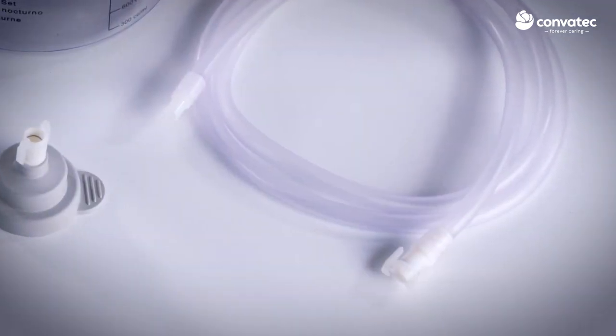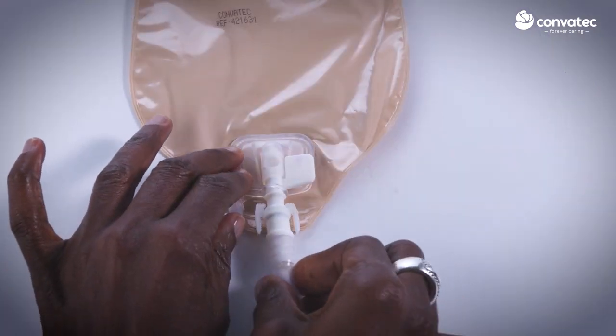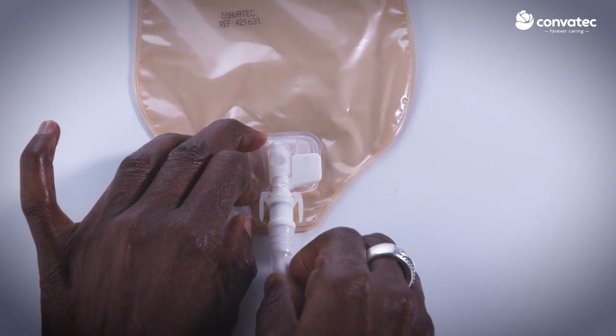Next, using the female end of the tube, which is the end with the clips, connect this end to the drain tap on the pouch. You may need to push firmly until you hear a click.